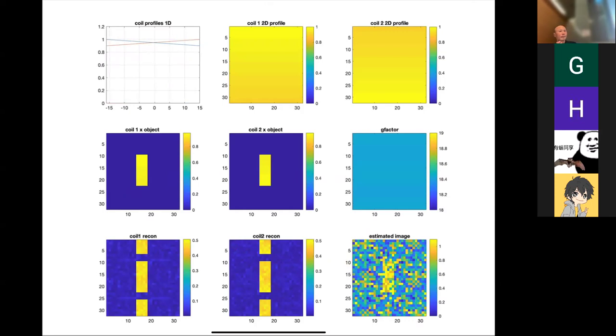Go ahead. Should we use then one coil in this case, if the shape or the profile of the coil is like this? If you had one coil, then you wouldn't be able to undo the aliasing though, right? Yeah. So we're counting on the fact that you have two, because with one coil, if you undersample, then you're still stuck with that sort of wide matrix. So the only way we get around it is adding another coil to go back and get enough data.